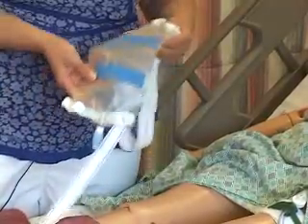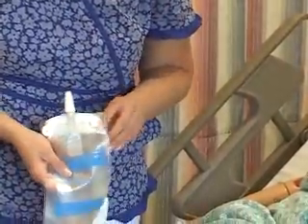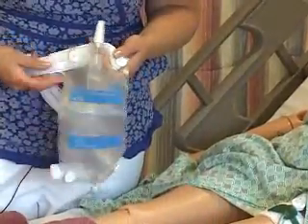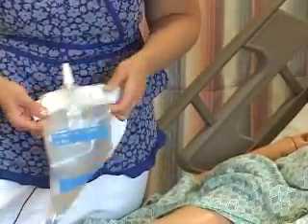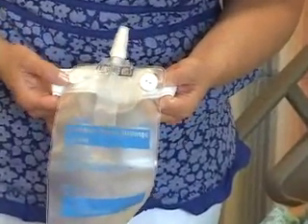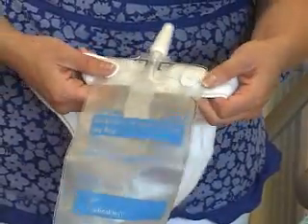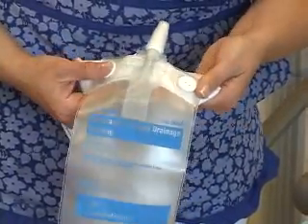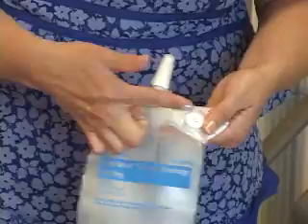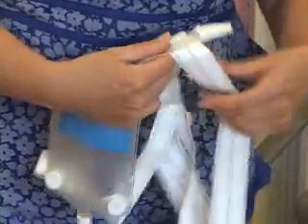It's very important, again, to use the leg straps that are with your drainage bag. This is attached to the leg bag. There's two for the leg bag, both the top and the bottom. There's buttons on the strap that come up from underneath the drain bag to attach to the drain bag. It's very important when you attach these straps that they are under the drain bag against your skin and not over the drain bag, as this could cut off the flow of urine.